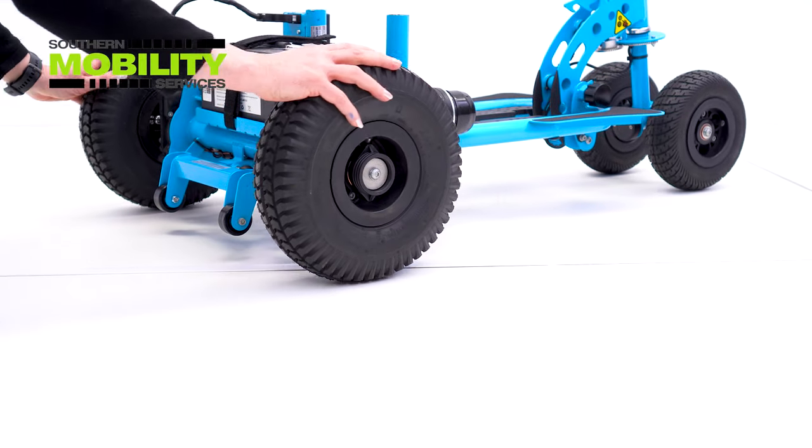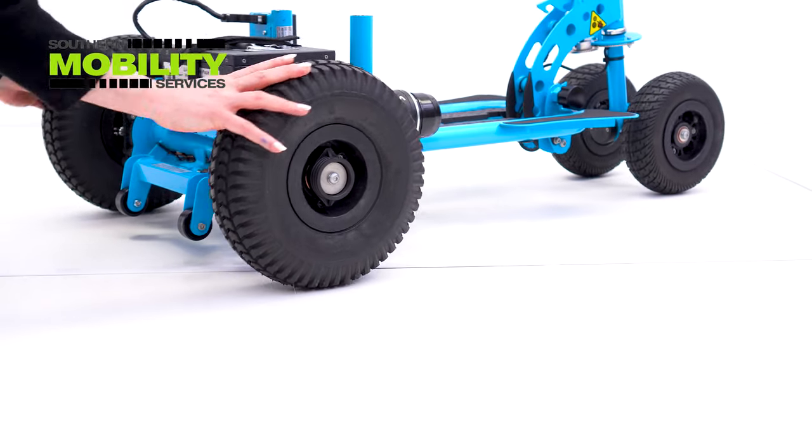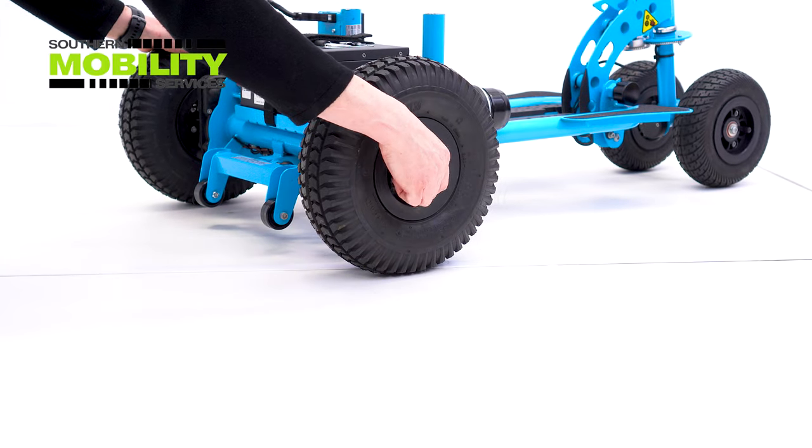The Sport HD has a mechanism where once released you can push the scooter and freewheel. It's simple to do — just pull out and spin the centre hub and that's all there is to it.